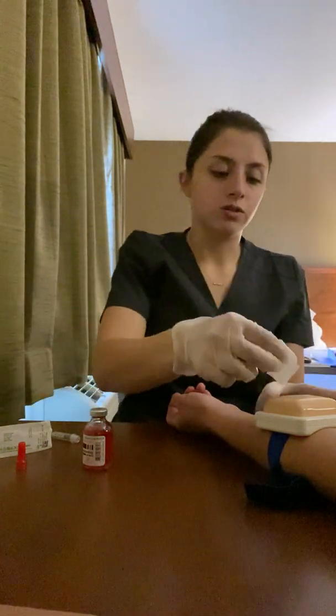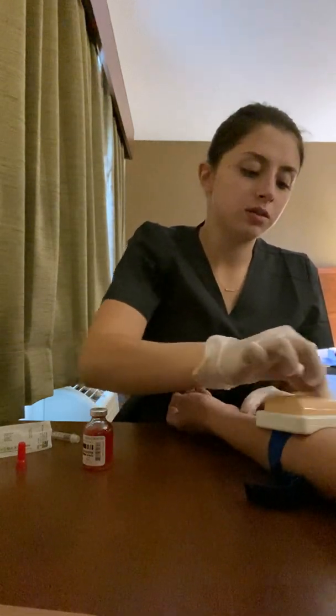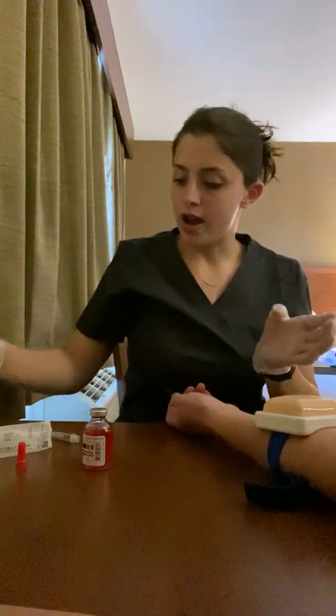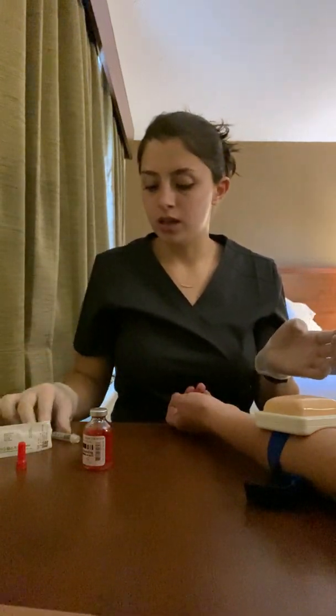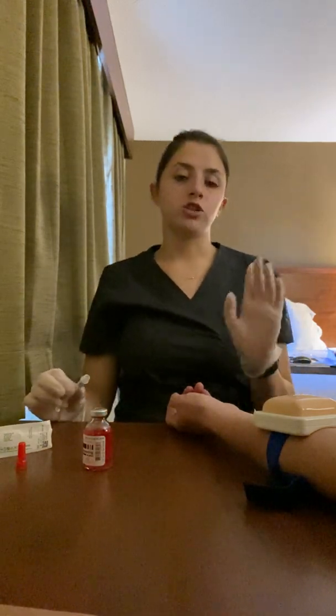Now I'm going to clean the site in a big circle and make sure that it dries before I inject the skin test, and I'm not going to blow on it or anything like that, and I'm going to make sure not to touch the area. So since it is dry, I'm going to take my non-dominant hand and stretch the skin.